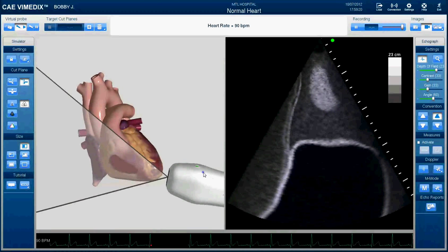Another important thing to note to get yourself oriented to the screen is this green dot. This green dot helps you — the ultrasonographer — get oriented to the view. This dot corresponds to this side of the plane of cut.